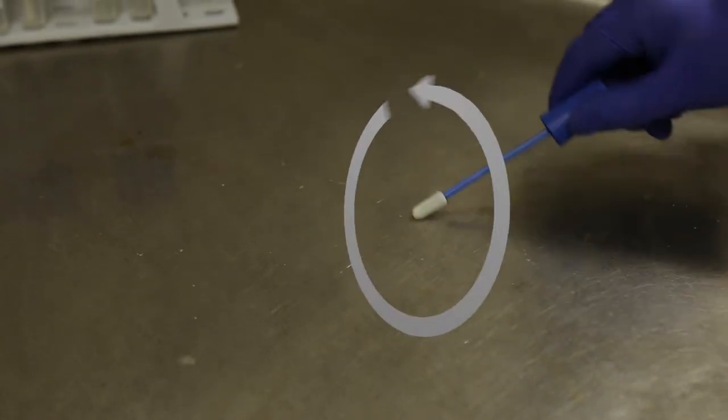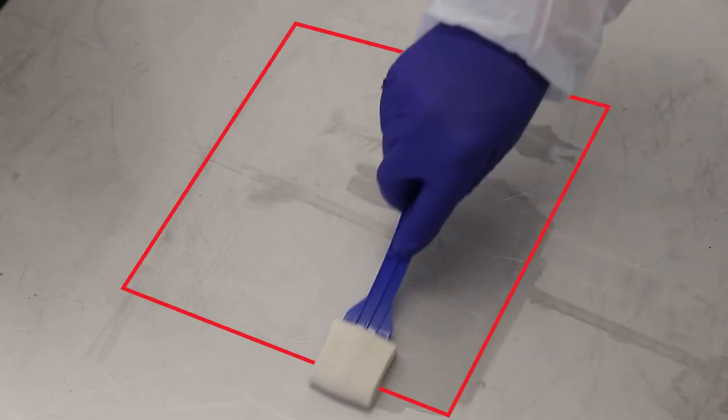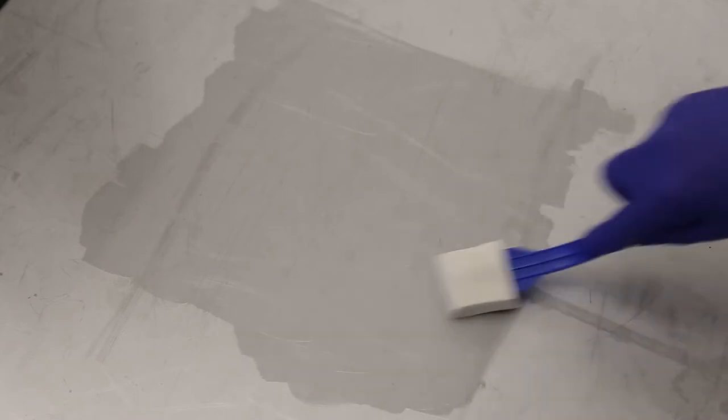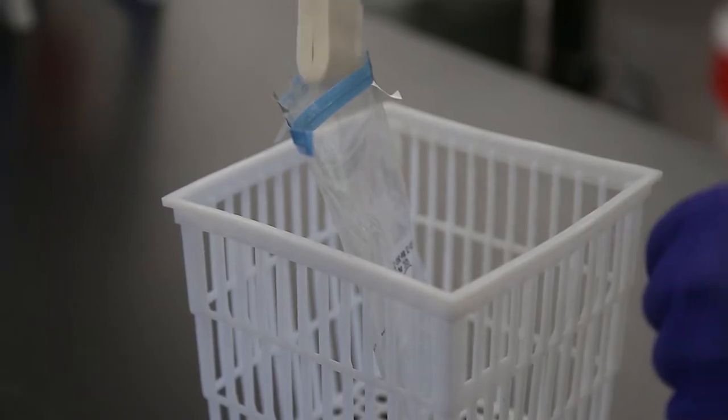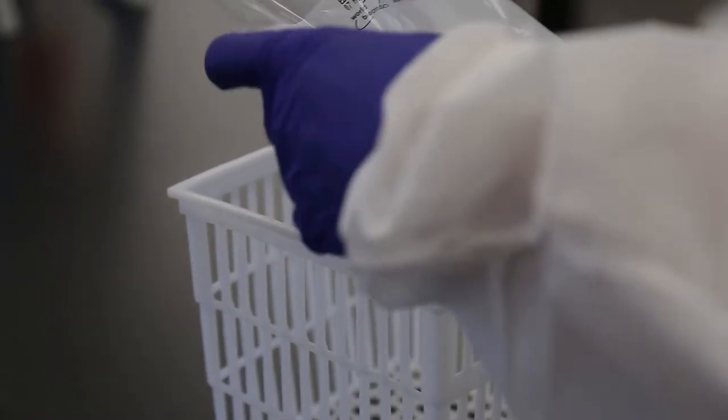While doing this, roll the sampling swab in your fingers. When using a sampling sponge, you should be able to cover an area that is about 12 inches by 12 inches. Apply equal pressure on the sponge as you vigorously sample going horizontally, vertically, and on a diagonal to cover the area.